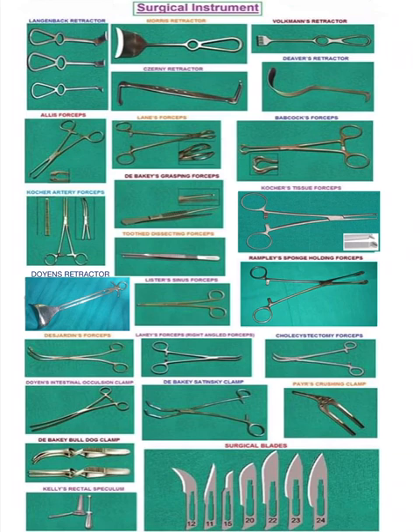See, first is the Langenbeck retractor. This is the L-shaped retractor guys. I think you can see the L. This is the L-shaped retractor. Then you have a Morris retractor guys. Then you have a Czerny. Do you see? It looks like a Z. So make the C silent. Czerny's retractor. See the C silent. So Zerny's. Okay. Then you have a Volkmann retractor.